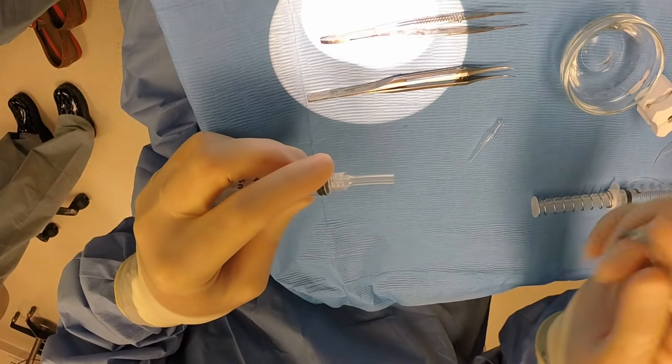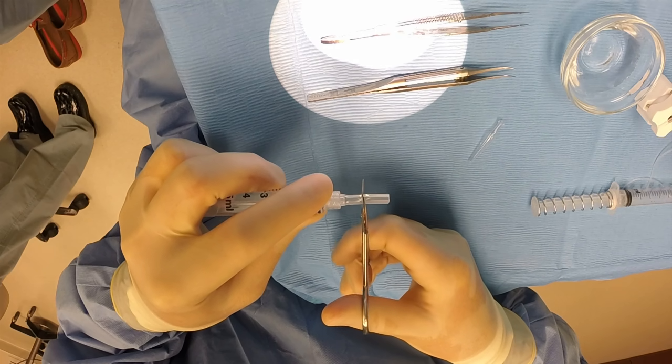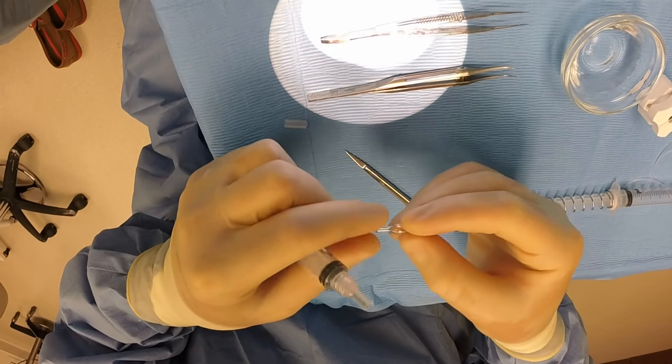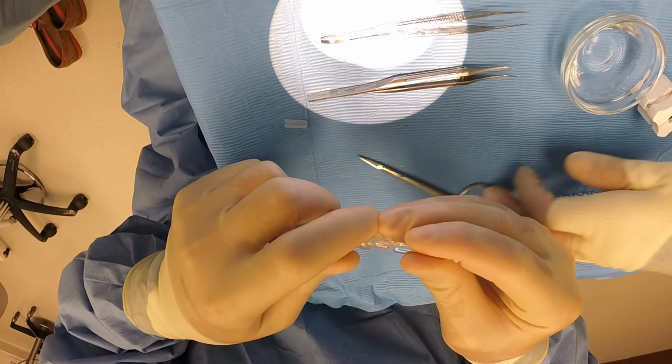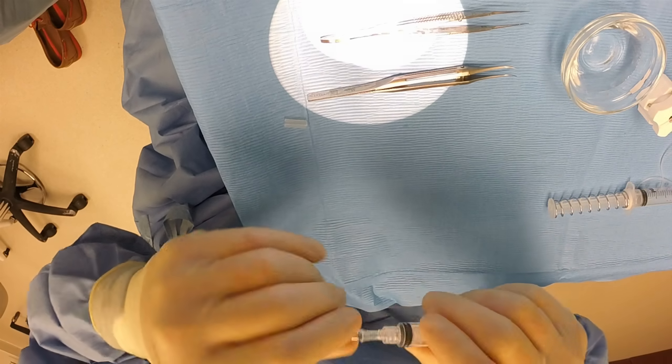Here I am cinching a silicone tube over the tip of a 5cc syringe and then cutting it to fit the Jones tube, which then I slide snugly into the silicone sleeve. I really like the silicone to couple it to the syringe.